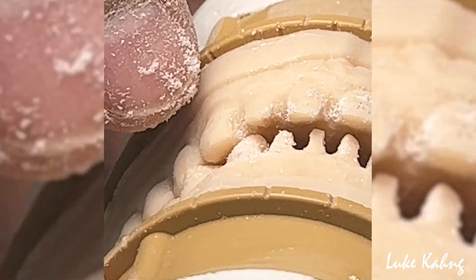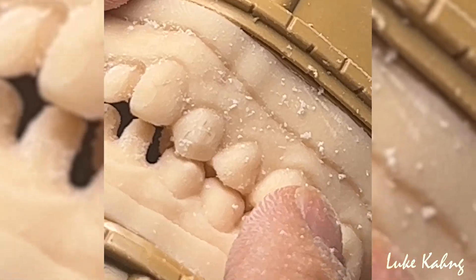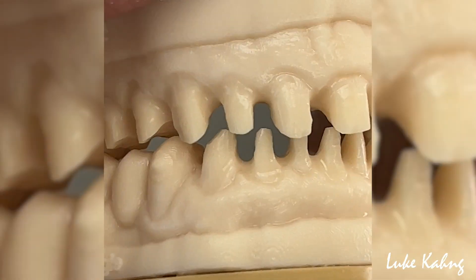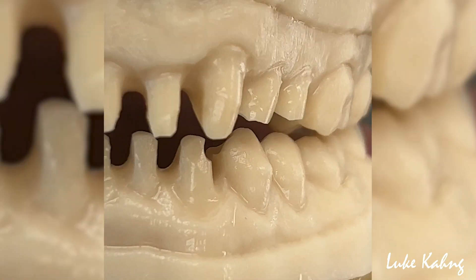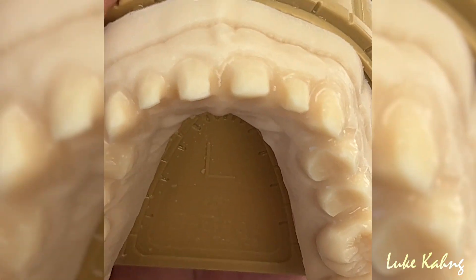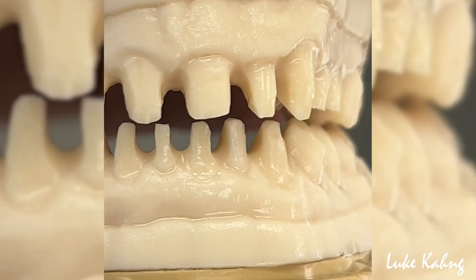I have to grind more of this, grind less, grind more. This is 6 unit and I'll put 10 unit. Okay, just have the preparations — that's what I'm looking for. And we can make the great temporary and the great final as well. 6 unit lower, or 10 units.